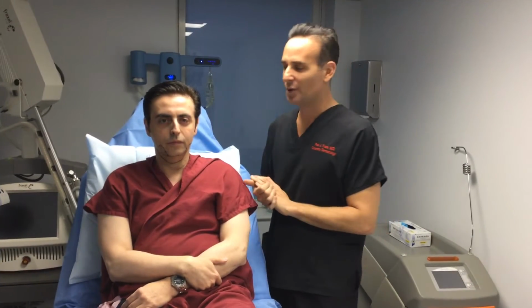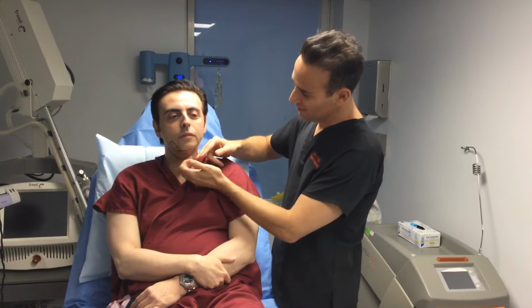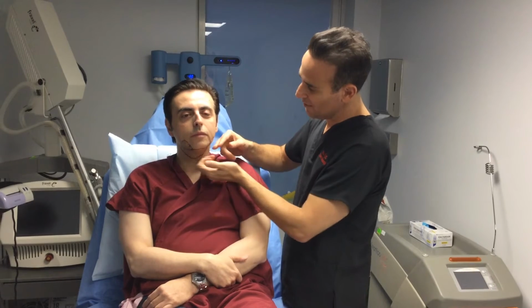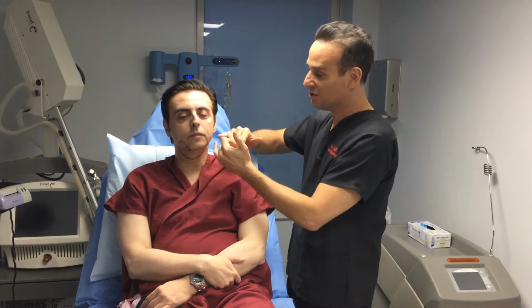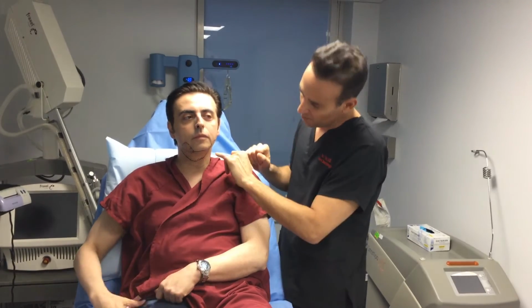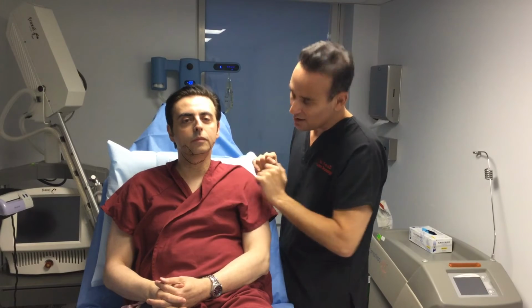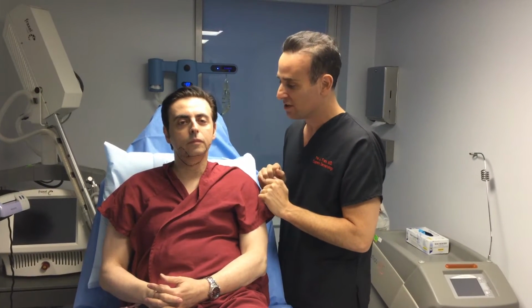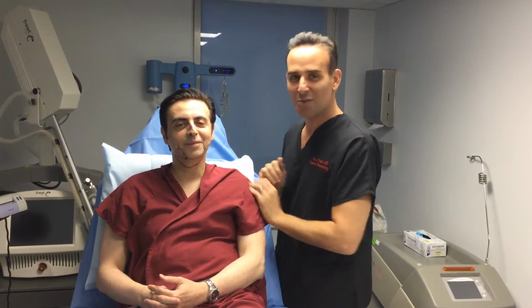We're in the OR with our patient, and we're going to do the UltraTight procedure today. This is something we're going to use to tighten up the jawline and try and straighten it out. It's a very common concern, particularly in men. They lose the definition in their jaw. What I'm going to be doing is going through two little holes, and I'm going to show you right here. We're going to be using local anesthesia to get him comfortable. He'll be awake during the procedure. He just has a little Valium on board, so hopefully he'll be a good patient.